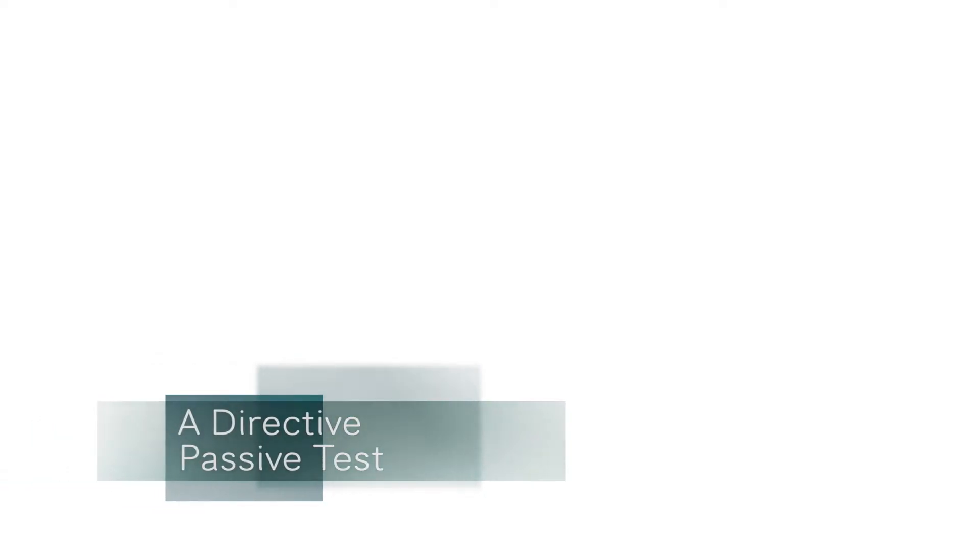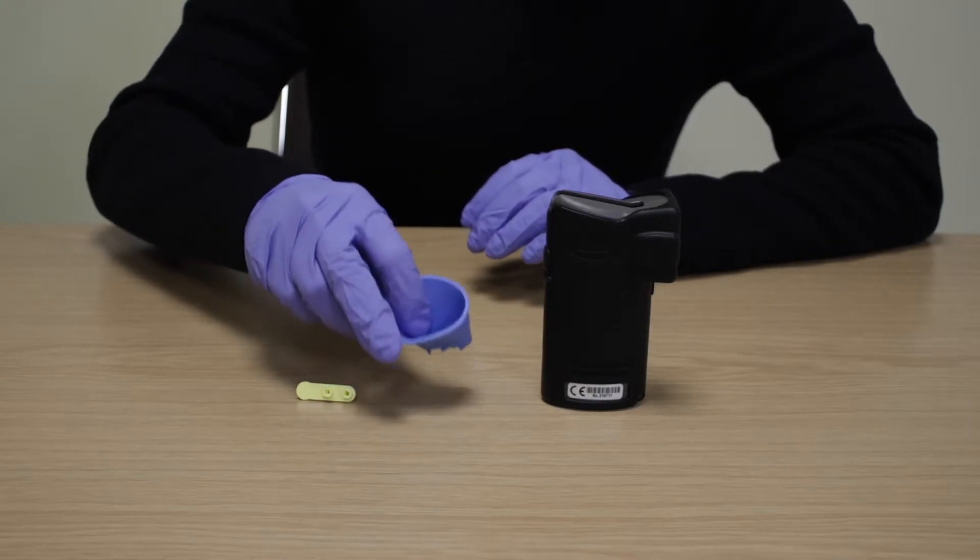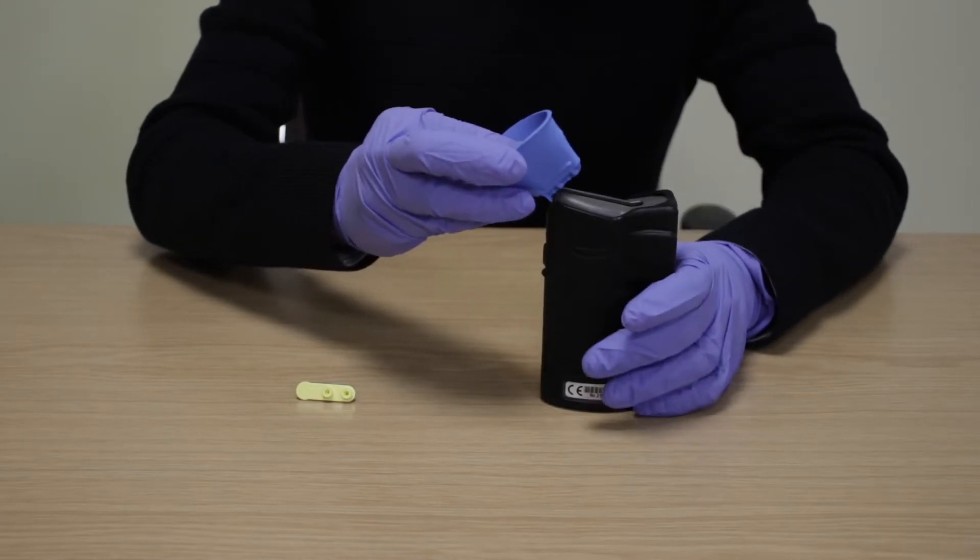A directed passive test. This passive test mode allows the operator to screen many people quickly for the presence of alcohol without the need for a mouthpiece. First you will need to attach the breath sampling cup to the device by aligning the holes over the inlet port and snapping into place.